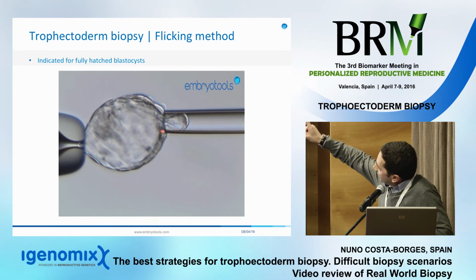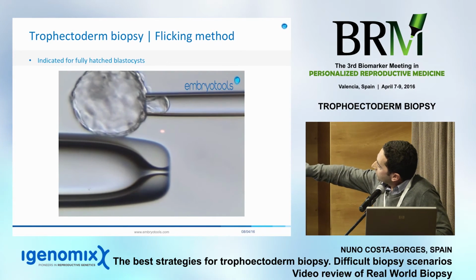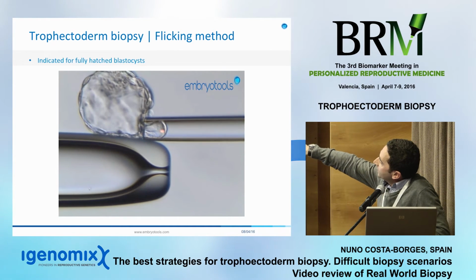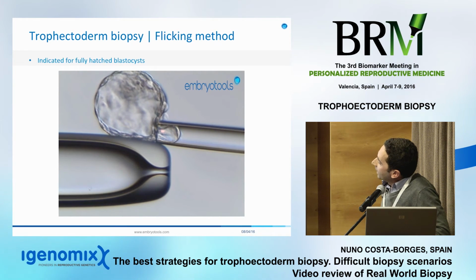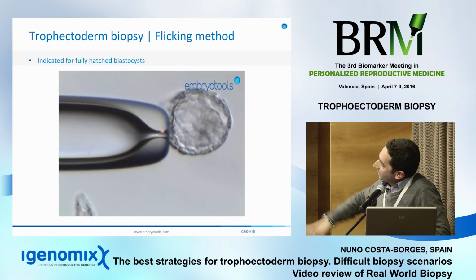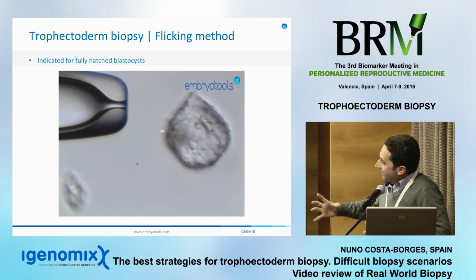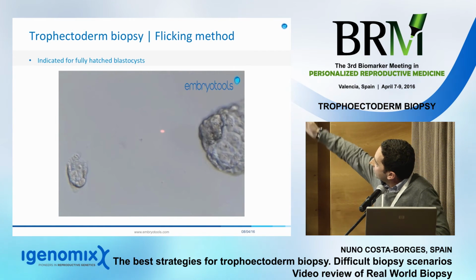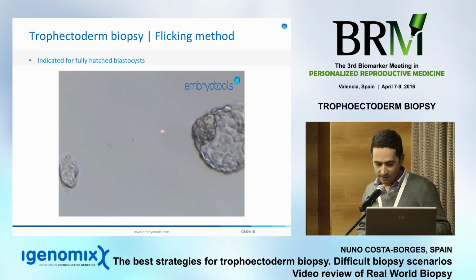So by the time you release the blastocyst from the holding, we focus this internal part. You bring the same focus of the biopsy needle that you have in the holding, and then with this small movement, well, it's not small, but it's a fast movement, you are able to split the cells. After just a few minutes the embryo gets back and re-expanded, and it's great. And then you can see there's almost no cells damaged, and it's very good. We're very happy with this method.